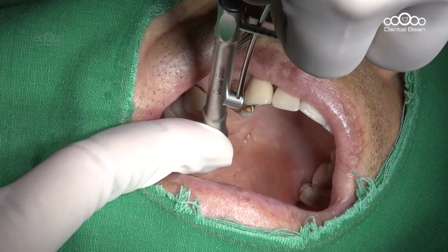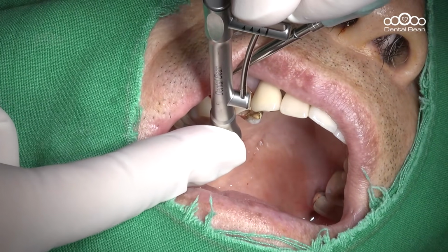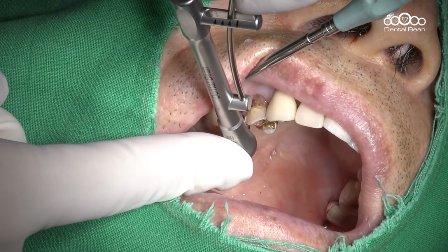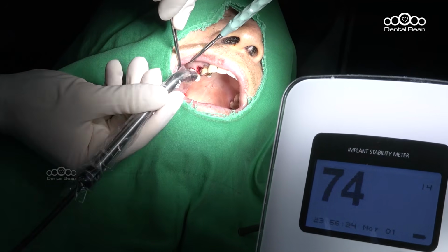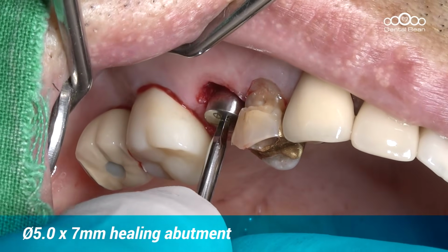You can see that the implant has entered the intended position. Final depth control is being performed using a torque wrench while checking how much torque is being achieved. The ISQ values are approximately 73 and 74, which indicates appropriate stability.